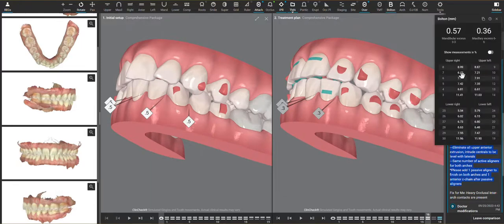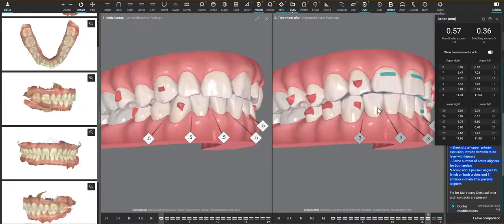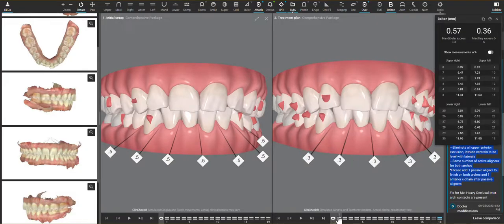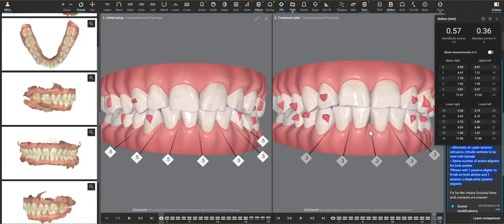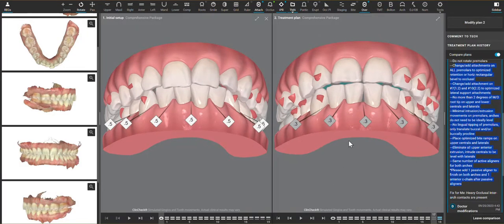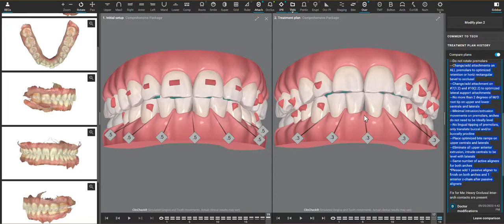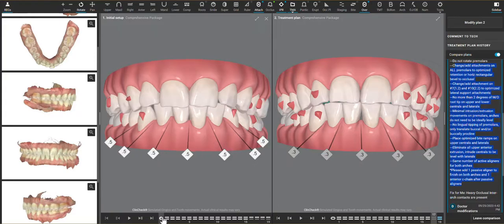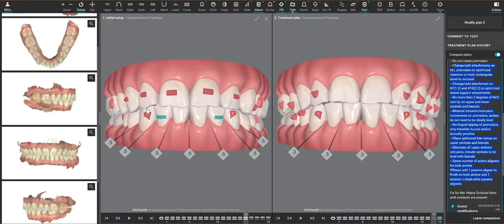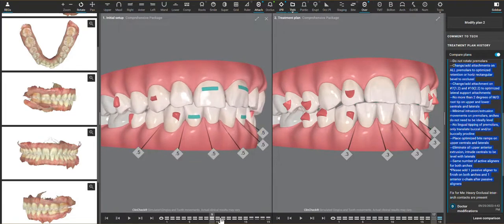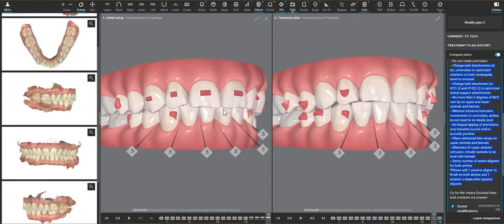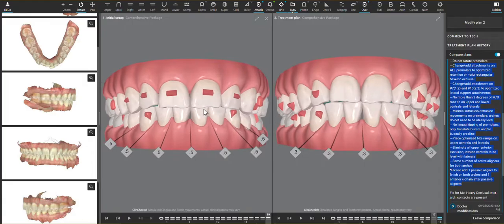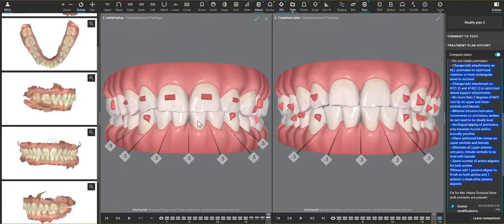What I wanted to bring up was the Bolton analysis because I'm seeing, do we have proportionately sized teeth upper and lower? What could we do? Do we need to do this lower IPR? Or could we eliminate it as a whole? You can see that there is a larger black triangle here at the finish than initially planned. There are fewer extrusion attachments because the software is trying to level the incisal edges and leveling the incisal edges causes extrusion of the teeth, but when the teeth have already been chipped and worn and are probably more deserving of restorations, doing those extrusions is not helpful.